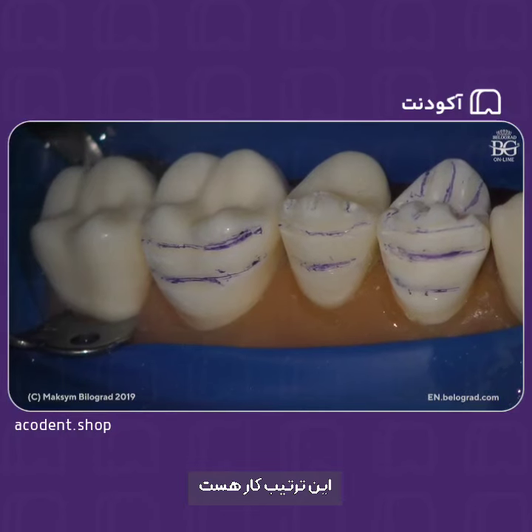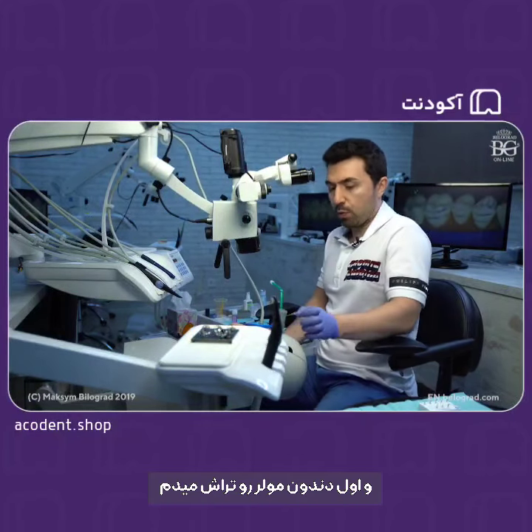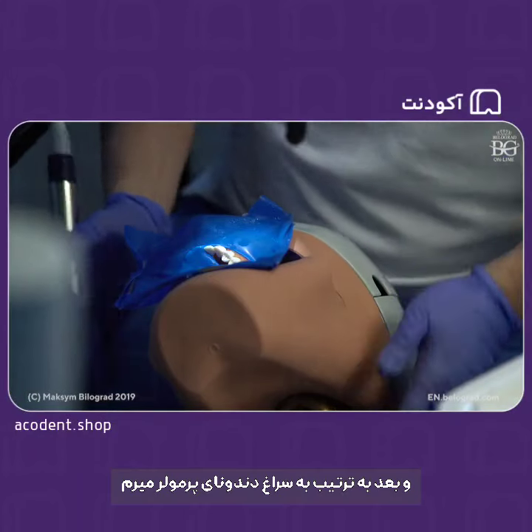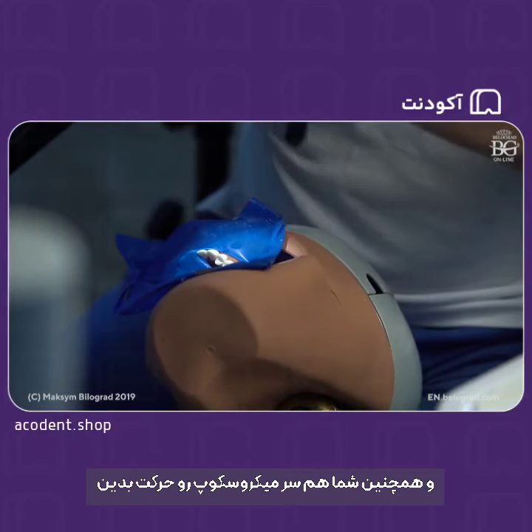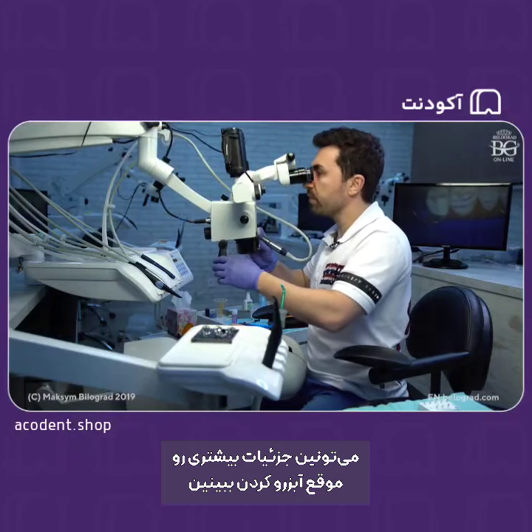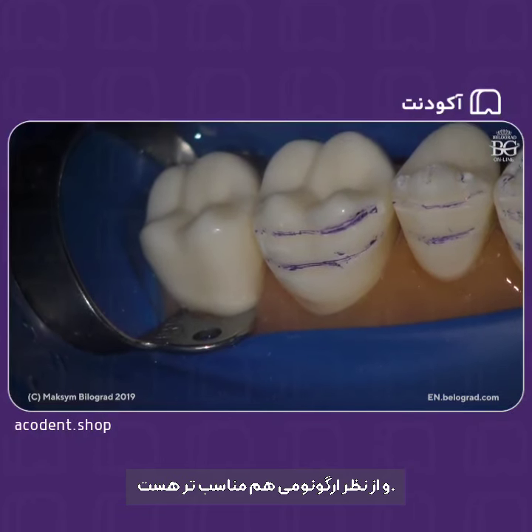This is the sequence. Considering the fact that we are working without a mock-up, I will just continue preparing these teeth. Okay, and I would just prep the molar tooth first, and then the premolar, and so on. In this case, if your patient can move the head more to the side this way, or you will also move your microscope, you will have more details for observation. Okay, so that will be easier for you to prep. You can see much more details. It will be more ergonomic for you.